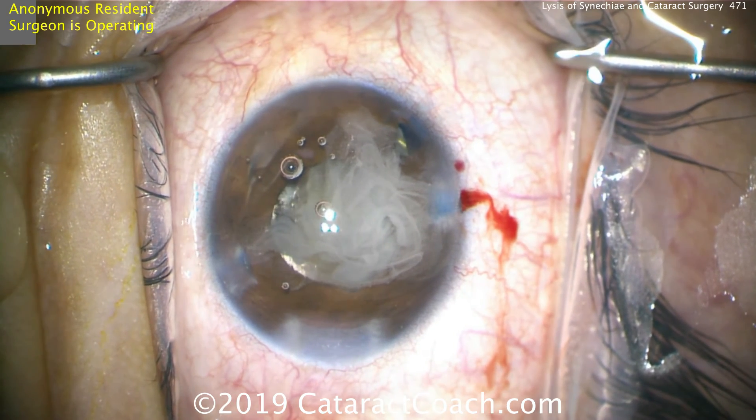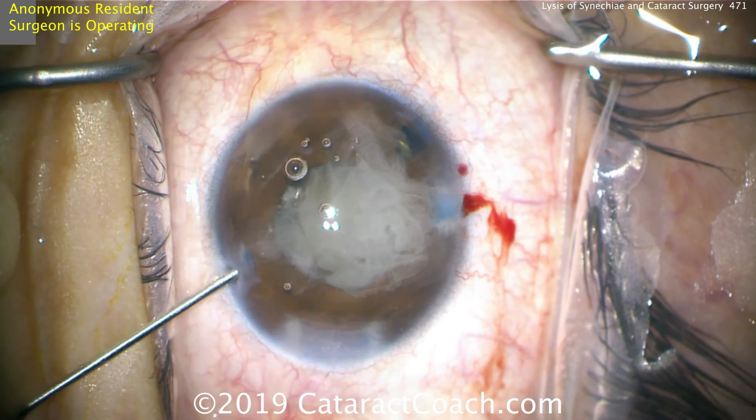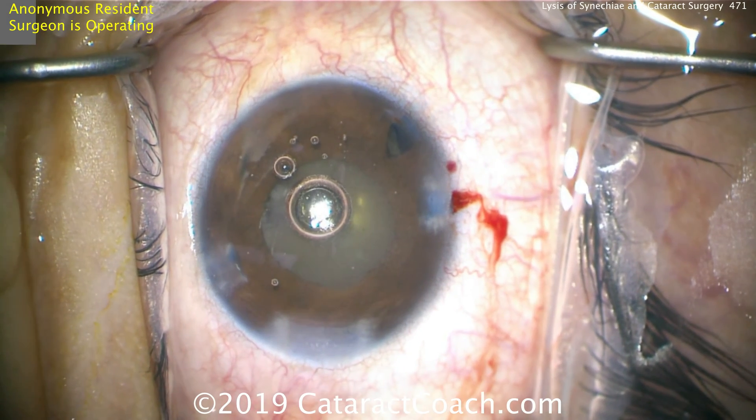Don't need much triamcinolone — a half milligram, maybe even one milligram — then swirl it around. This is a patient with a uveitic eye, so we're expecting a lot of post-op inflammation. Having this triamcinolone on board is going to make a big difference.